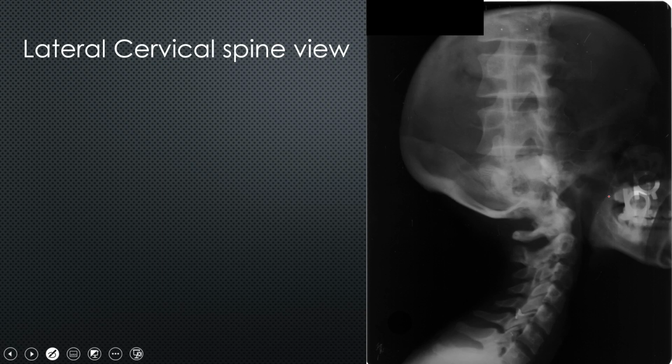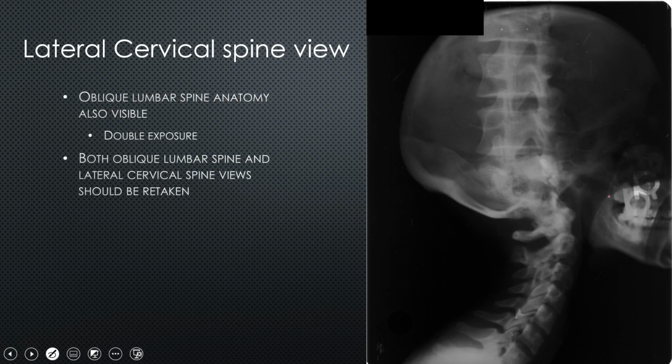Lateral cervical spine view. I don't know about you guys, but some people have lumbar spine in their skull, apparently. Kidding, but as you can see in this lumbar spine view, an oblique lumbar spine view was also taken. So obviously, the oblique lumbar spine view and the lateral cervical spine view both need to be retaken separately.